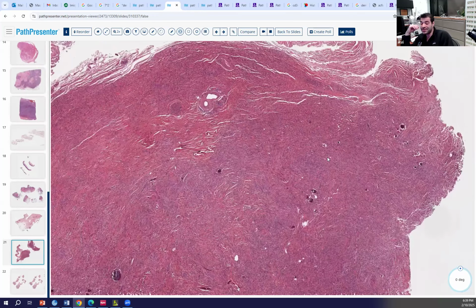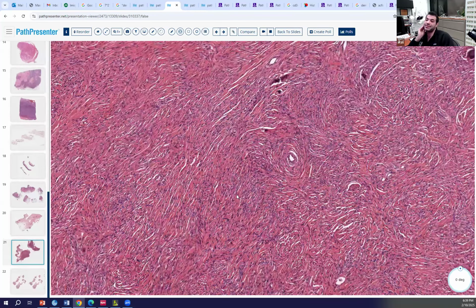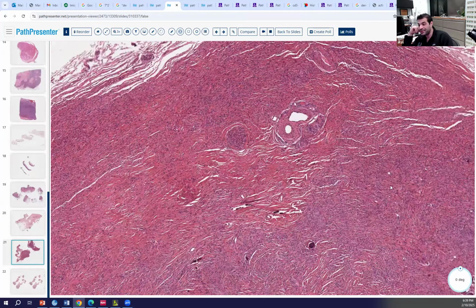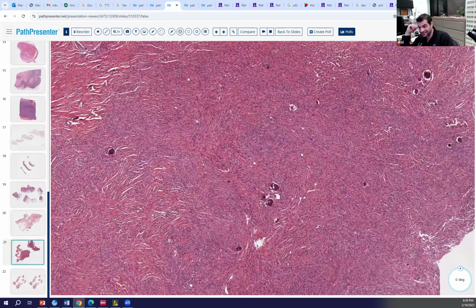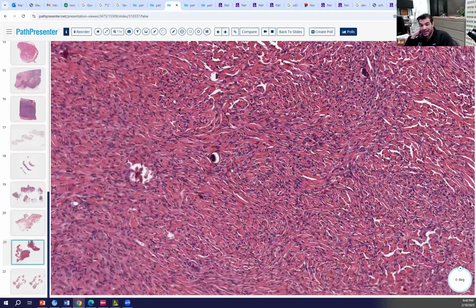Fine. Now there's different types of meningiomas. There's meningothelioid meningiomas, there's fibrous meningiomas, there's even something called psammomatous meningiomas, which have way more psammoma bodies than this. In fact, it's kind of all psammoma. This is probably the most common one, meningothelioid meningioma. But yes, very good. Good job on the psammoma bodies.